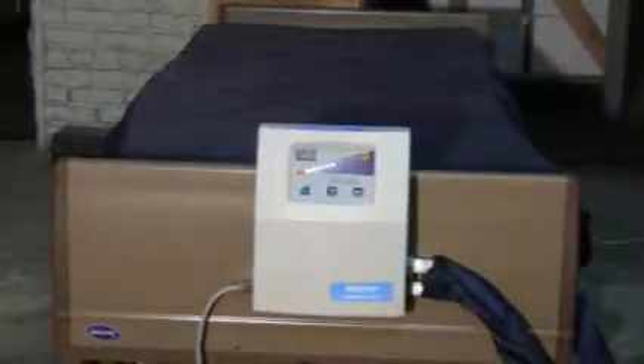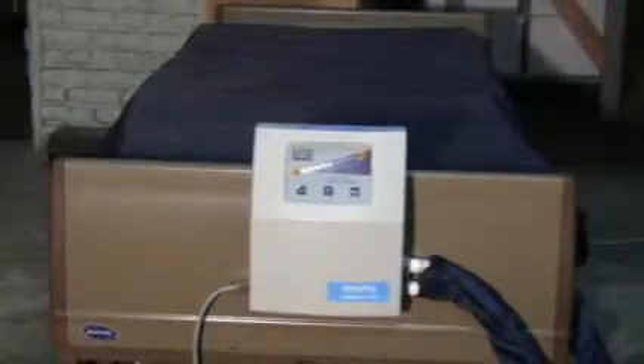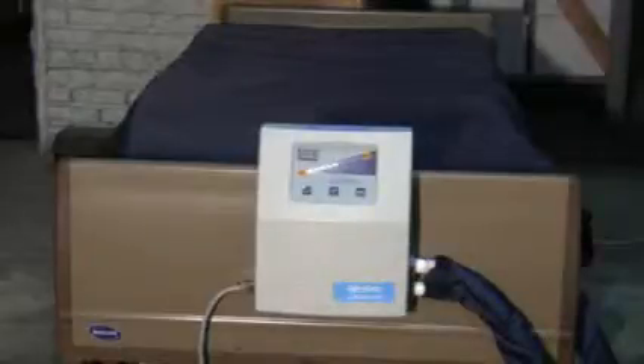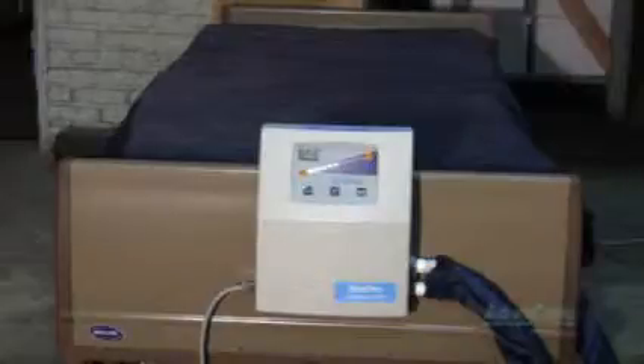If you need sheets to cover your Plexus 2500 low air loss alternating pressure mattress, you can use one fitted sheet if needed and one flat sheet if needed. If you need bed pads for incontinence, you can use one bed pad. The more material between the patient and the surface area of your low air loss mattress, the less therapeutic it will be for the patient.